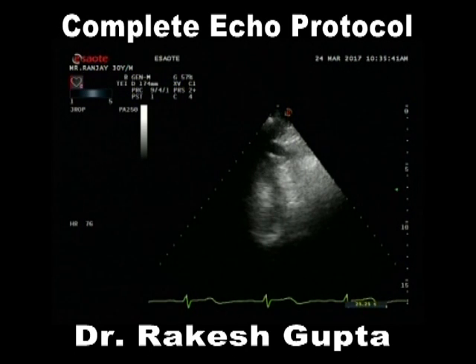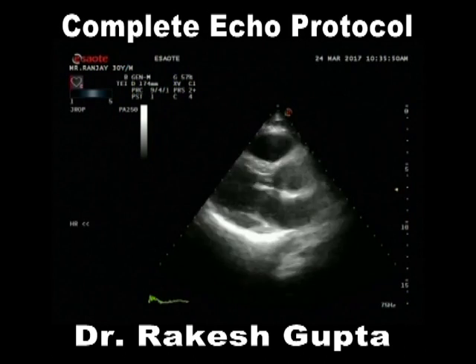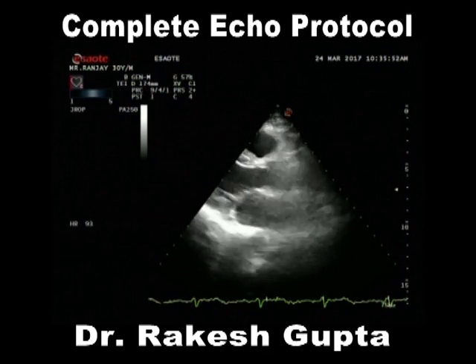This is what the 2D scanning is. And once we have done this 2D scanning, the other thing which makes a lot of difference in 2D scanning is the measurements. How do we measure the 2D scanning measurements?